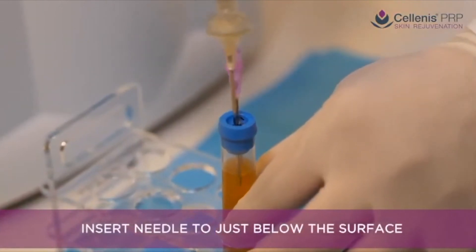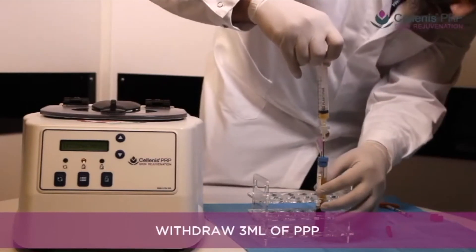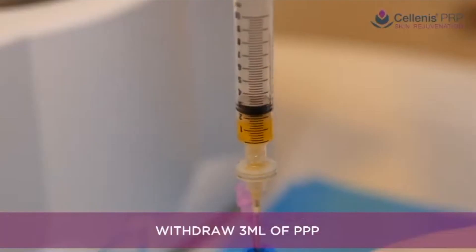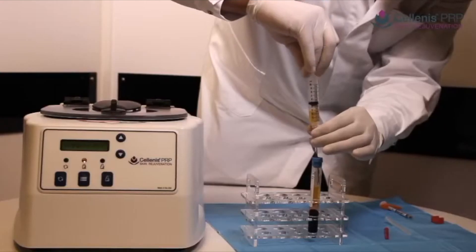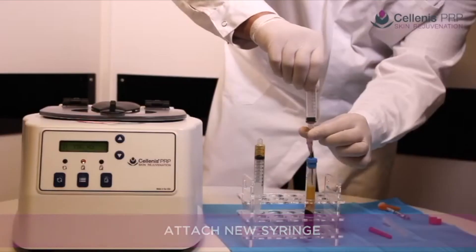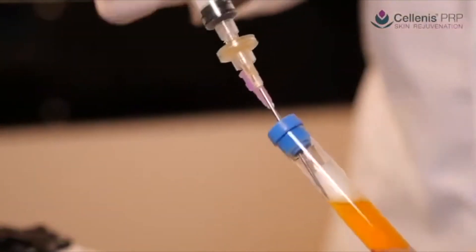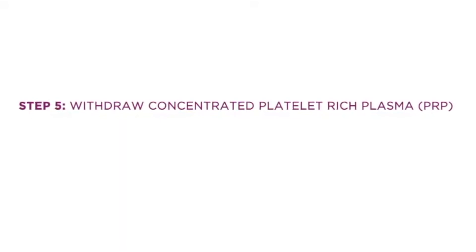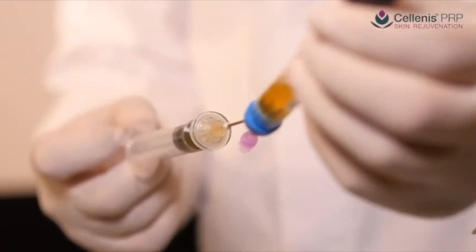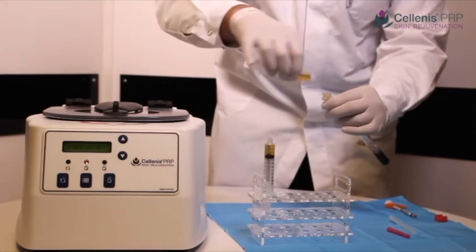Removing 50% of platelet-poor plasma will increase the platelet count to approximately 1 million platelets per microliter. Set aside the PPP and attach another syringe of your choice, keeping the disc filter in place when attaching new syringes. After the platelet-poor plasma has been removed, the important step of resuspending the platelets must take place. This resuspension step distributes the platelets within the smaller volume of plasma, and high-concentration Solanus PRP is now ready to inject into areas where a high level of growth factors will produce optimal benefit.